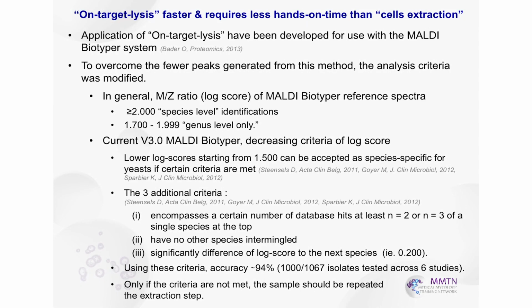The on-target method has less hands-on time than cell extraction, but the analysis really has to be developed and adjusted. If the cut-off point is very high, it is very hard for the real world. So they try to adjust like this.